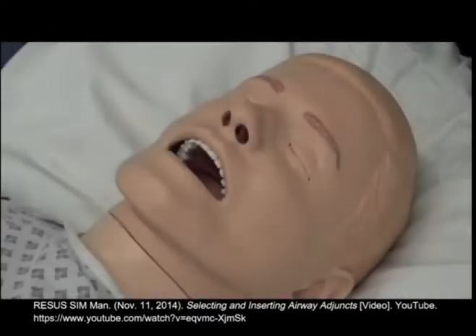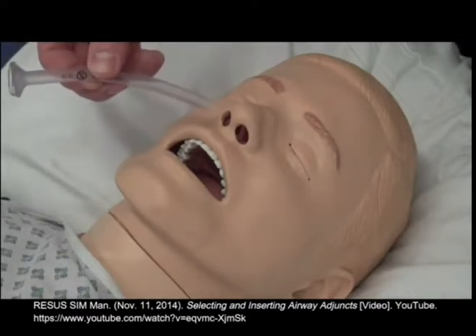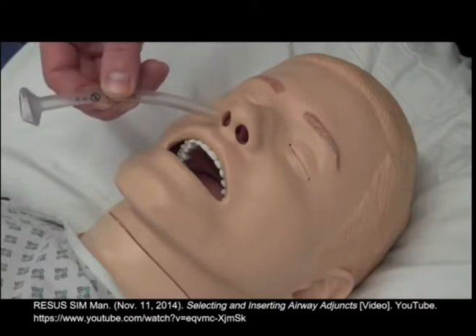Once you have selected the right size nasopharyngeal airway, ensure you apply a water-based lubricant before insertion to ease its passage into the nostril. Stand at the head of the bed, holding the NP airway like a pencil, with the bevel pointing towards the septum of the nose. Insert it into the patient's right nostril, as this is often larger than their left.